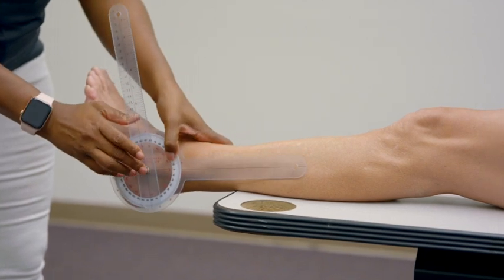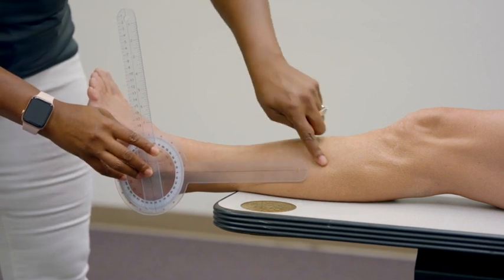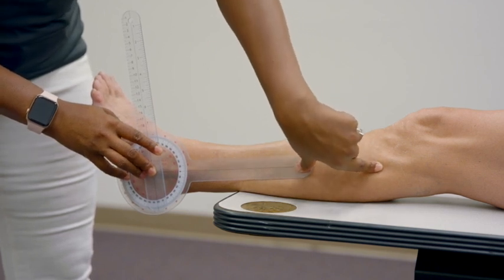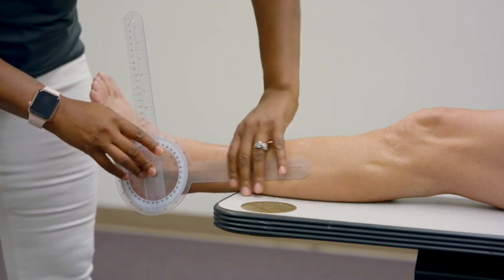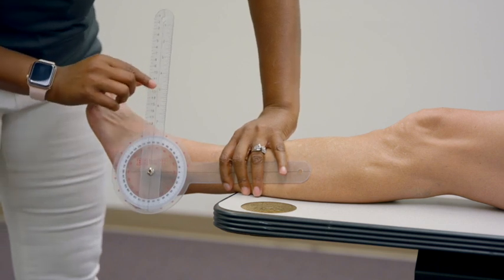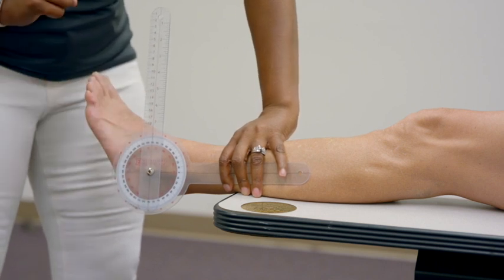Place the metal piece right on the center portion of the fibula. You might ask how do you know where it needs to be — first find that fibular head. Extend your finger out to make sure it's in alignment. Once aligned, clinically I place the goniometer at zero degrees, or what some consider to be 90 degrees.